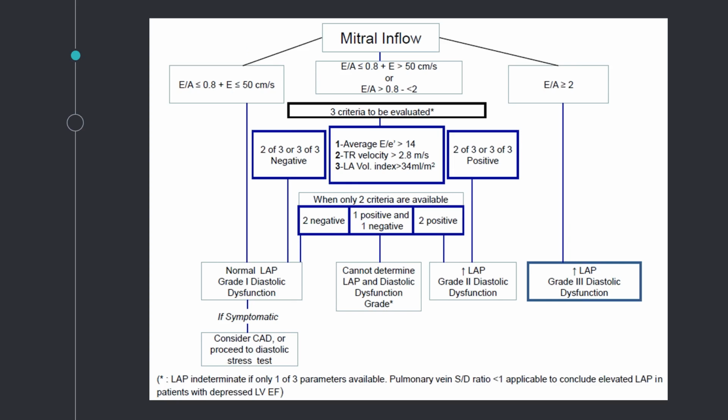Chiming, yes. When you say bring it into the flow diagram that's shown here, do you mean consider it as somebody with LV systolic dysfunction or myocardial disease, and then try and differentiate further based on this second algorithm? Is that what you mean? Yes. So some people do that, and when you talk to some of the colleagues who actually wrote this paper, they do that too. So that's not well spelled out in terms of how to deal with the indeterminate.